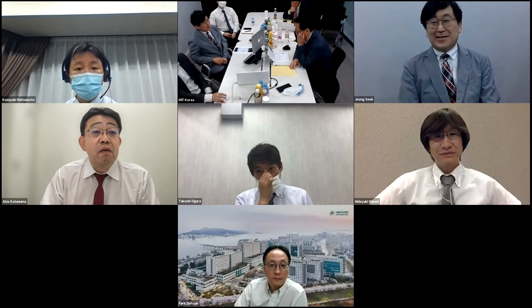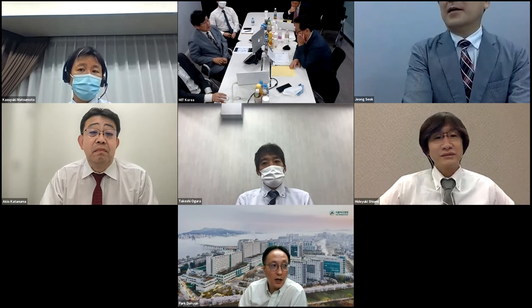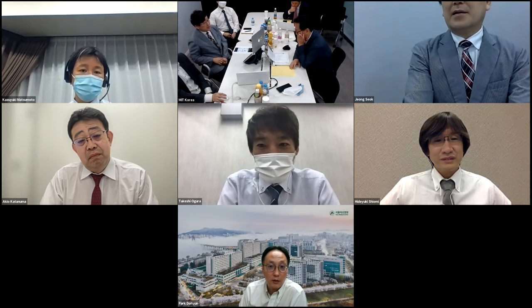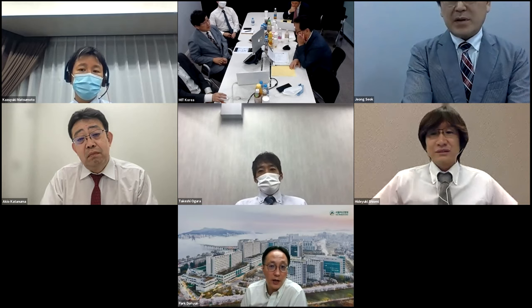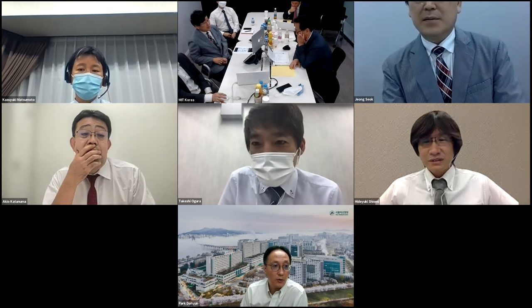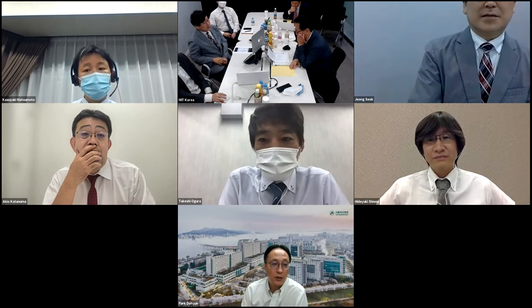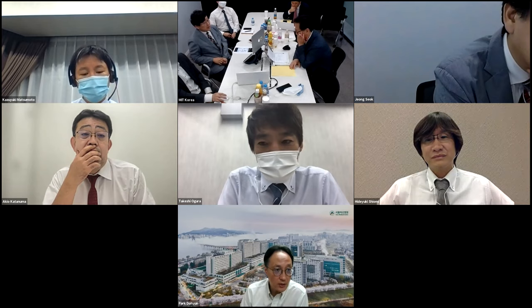Thank you for your excellent talk. In Korea, it's a very similar situation. Before, I submitted a request for stents for afferent loop syndrome to the government, and it was rejected as a new technology. It's very disappointing that it's not approved. I think your stent is very useful, but its length is more important, because after decompression of the bowel, the bowel is far away from the stomach, so there is a possible chance of stent migration. Maybe 9 cm or 10 cm is better.